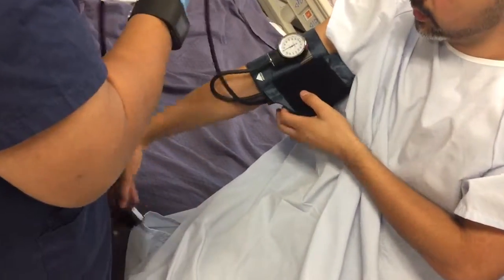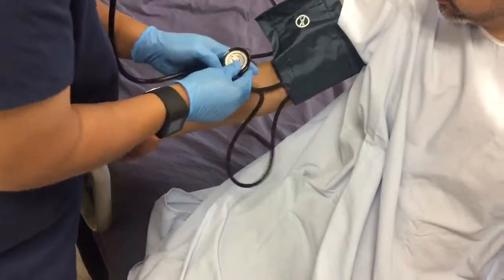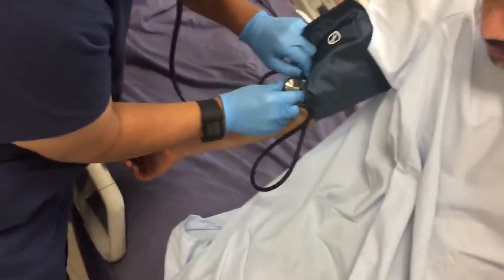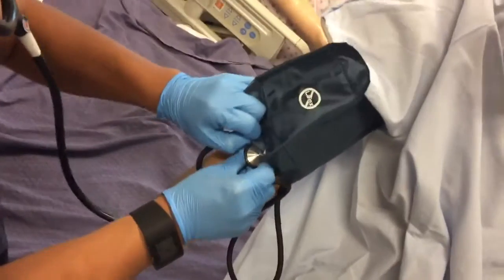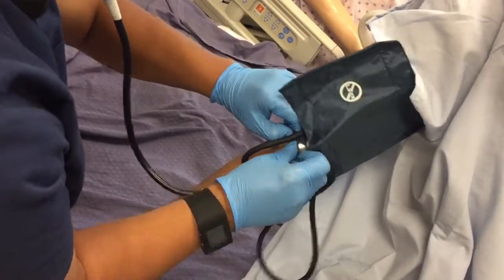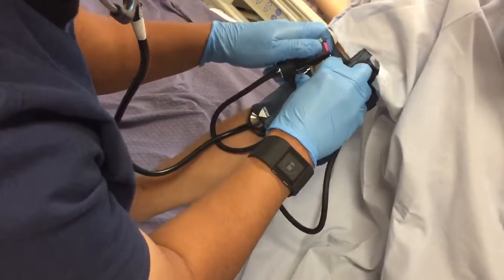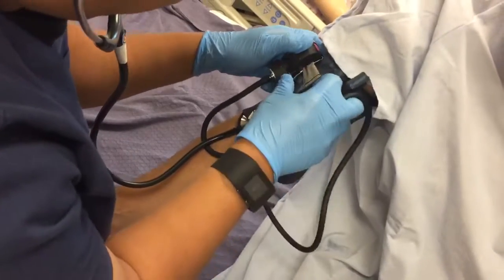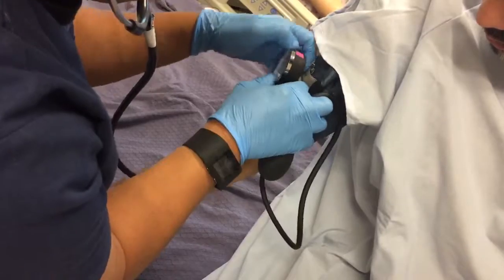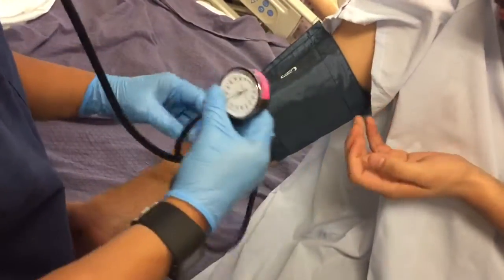Okay. Again, patient's pulse was 20 beats within 15 seconds, times 4 for the minute. That gives me 80 beats per minute, in the normal range. Respirations 4 within 15 seconds, times 4, that gives me 16, so normal respirations. And O2 is 98%. Okay, I'm also going to check your blood pressure again. If you don't mind holding on to this for me.